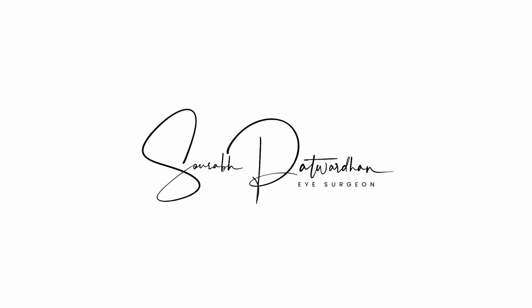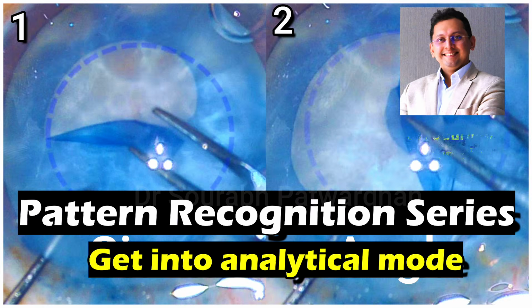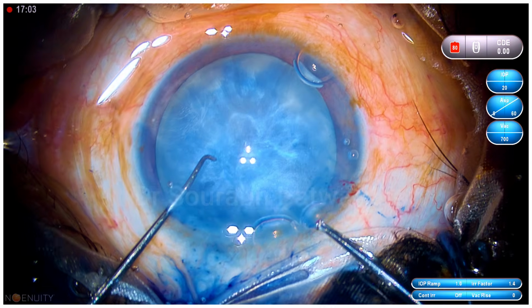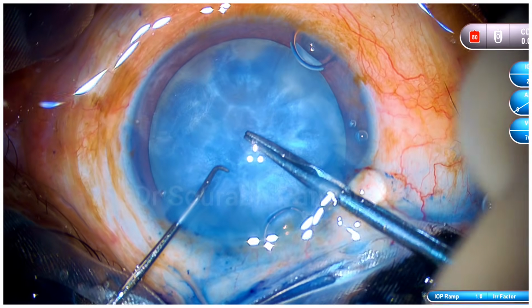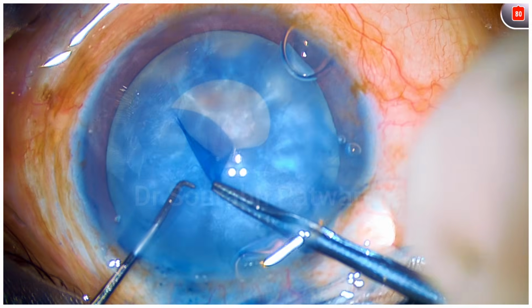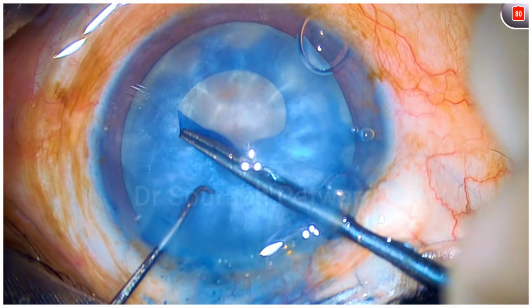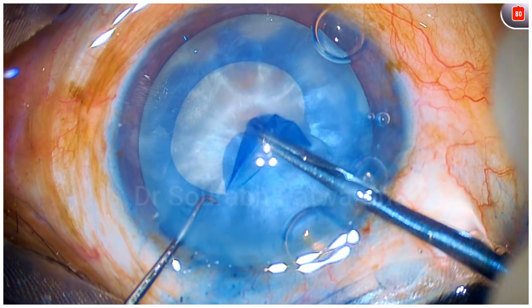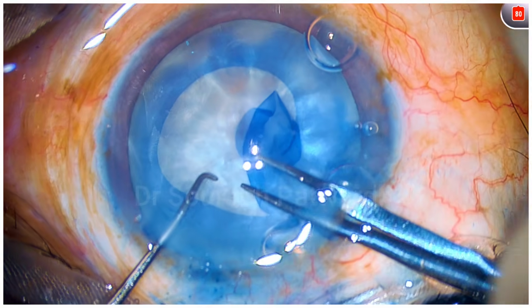In this video, I am going to talk about the pattern recognition for detecting the CCC extension risk. So let's get into analytical mode here. Just watch this video where the surgeon is doing capsulorhexis in an intumescent cataract with the use of heavy dispersive OVD in the anterior chamber, and the first flap is made. And as the surgeon goes, you can watch that the CCC tends to get extended here.